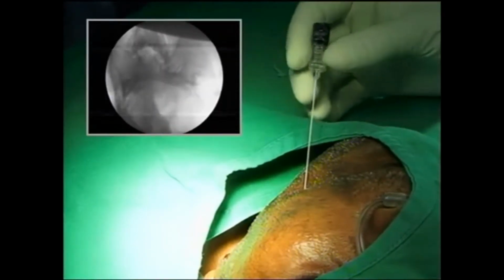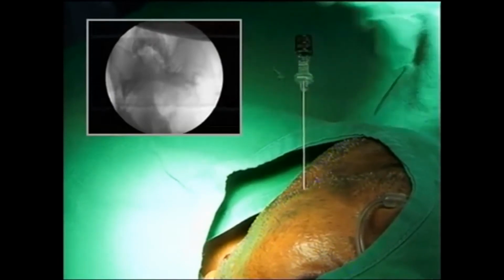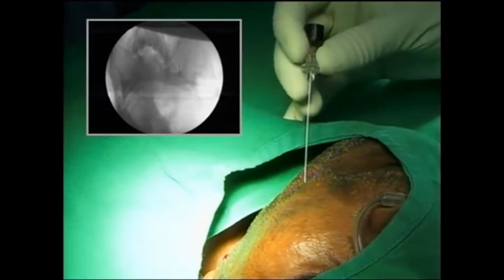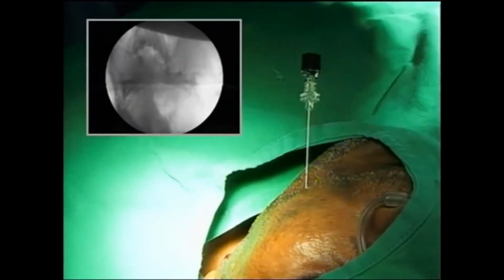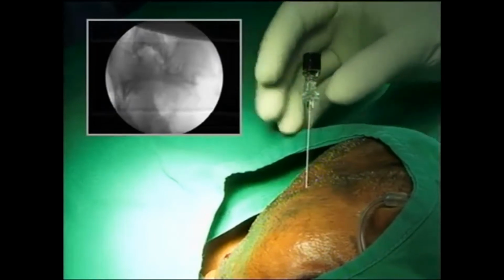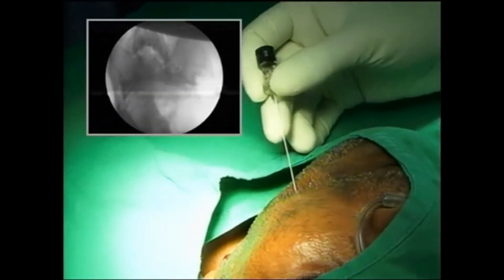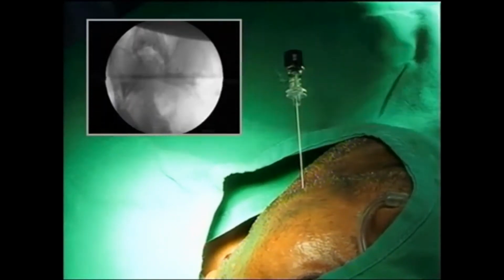Okay, I'm getting there. So I just have to move it a little bit more medially. Getting there. So one of the things that if you're a beginner you can do is you can hit the walls of the foramen ovale, so you get the idea of depth. So once you hit the depth, then you can walk over into the foramen itself. If you're reasonably experienced, you can go into the foramen ovale itself and then shift to lateral view.